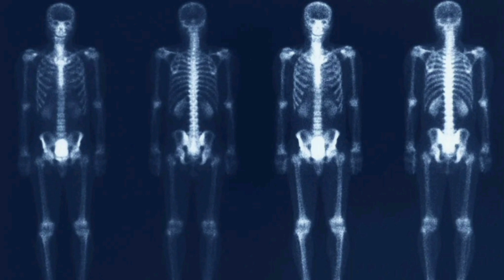3 phases. Blood flow phase, which is 1 to 2 minutes, it's called angiogram. Blood pool phase, which shows increased vascularity due to inflammation, it's at 30 minutes and can detect infection. And then the bone phase, which is at 4 hours.